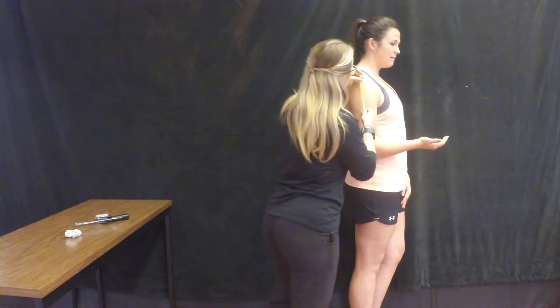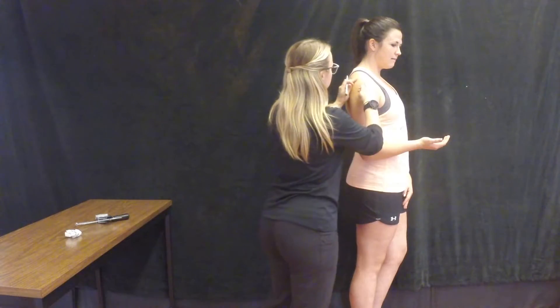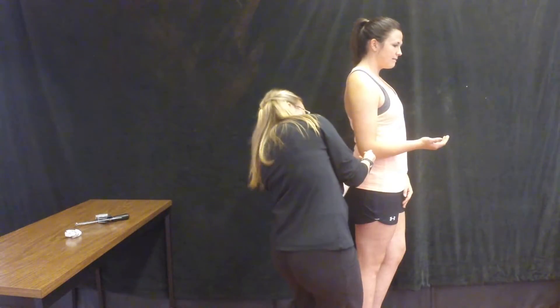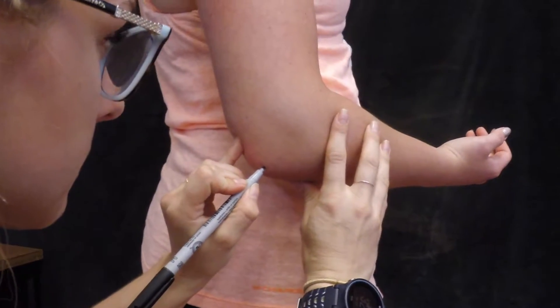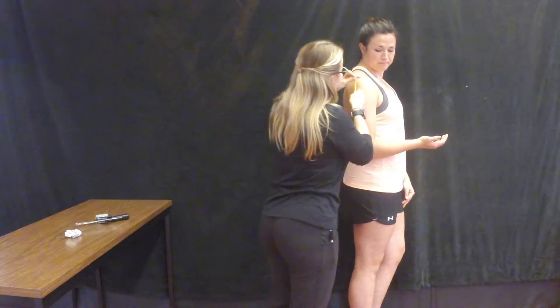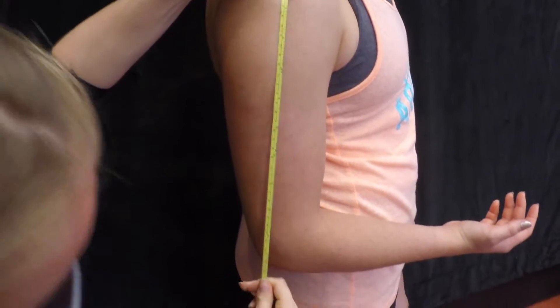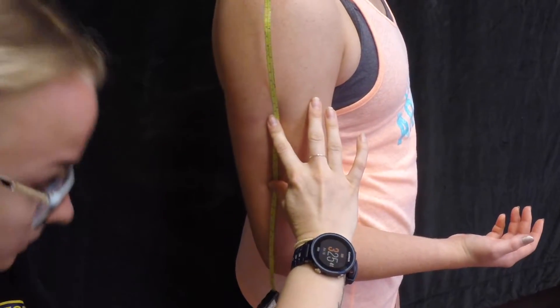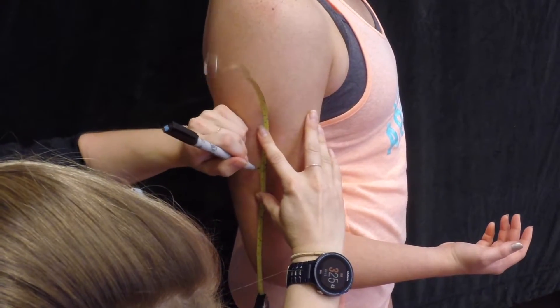To do the bicep skinfold, make a mark at the midpoint between the superior lateral acromion process and the olecranon process. Use a tape measure to mark the midway point between these two marks on the lateral aspect of the arm. These are the same first steps for the tricep skinfold measurement, so it's best to do these at the same time and use the same marks.